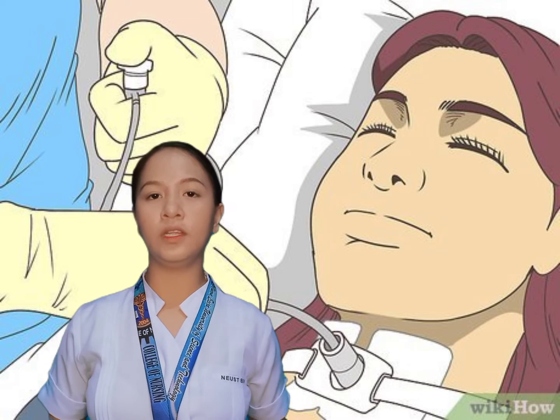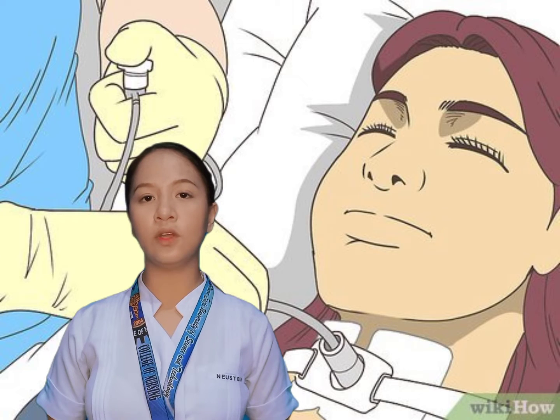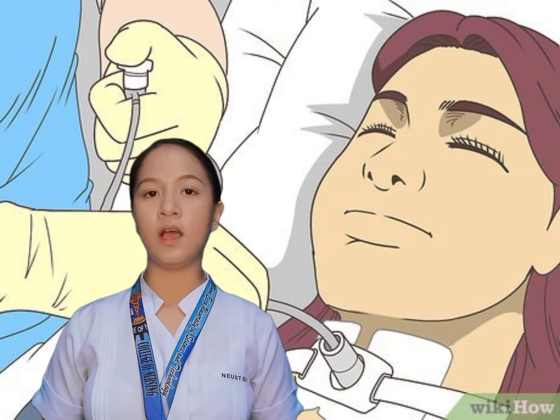Discard gloves and put on another gloves if necessary. Dry the inner cannula using sterile gauze or pad. Gently reinsert it back to the tracheostomy tube. Be sure it is properly locked.